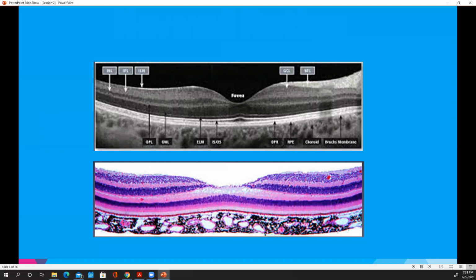An example I give is there are certain metals, literal pieces of metal, that are optically clear. In other words, they're optically not dense at certain wavelengths. So if you're at your regular visual spectrum and you put this piece of metal on the actual retina, you wouldn't see the retina, you would see this big piece of metal. But if you did the OCT, which uses specific wavelengths for its reflectance patterns, they would pass through it and you would see the OCT perfectly. So again, pathology does not equal the image, but it's a reflectance pattern that is analogous to it. Does that make sense?